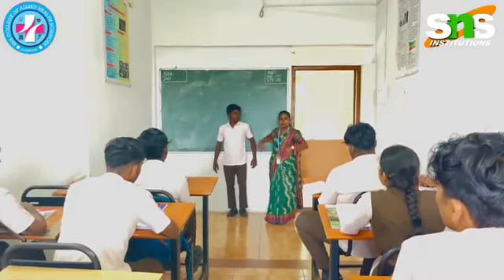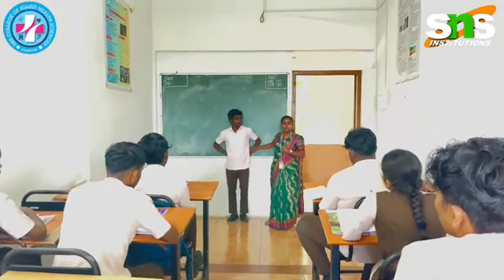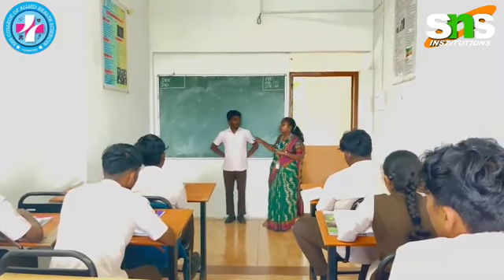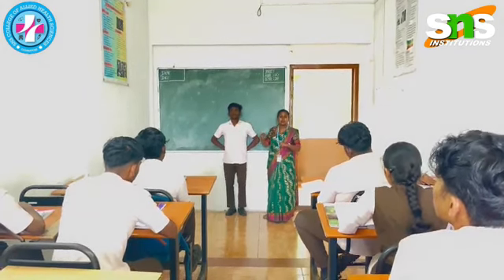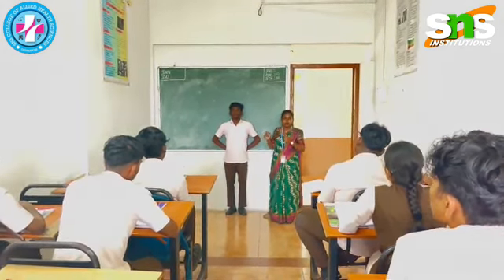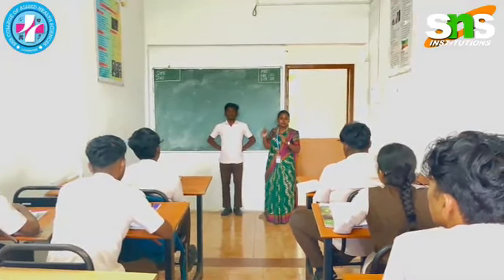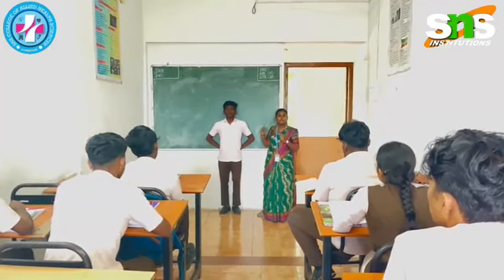The hands are kept the same as in the PA projection, positioned at the hip, and the patient has to slightly raise their chin up. The patient has to be instructed to be in breath hold position, and we have to expose until the exposure is completed fully, so we have to insist the patient holds their breath.